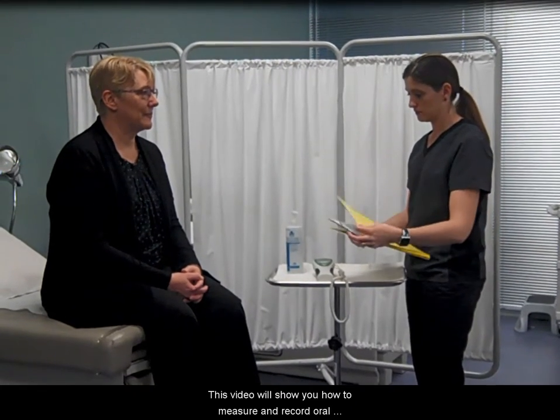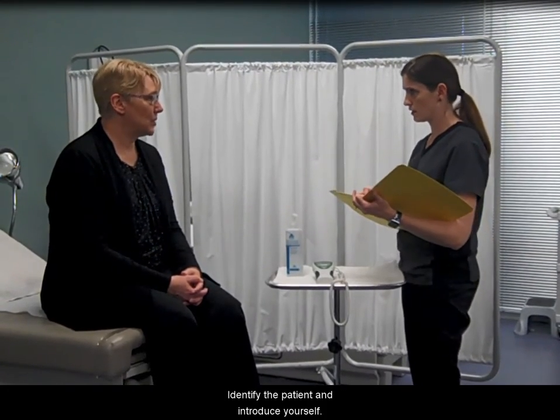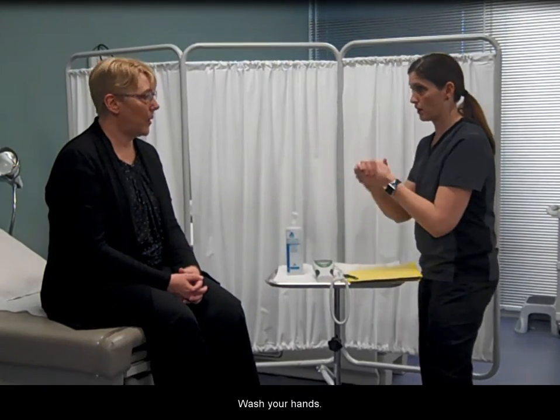This video will show you how to measure and record oral temperature with an electronic thermometer. Identify the patient and introduce yourself. Wash your hands.